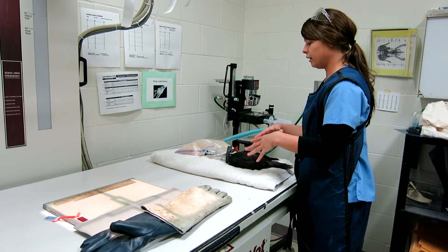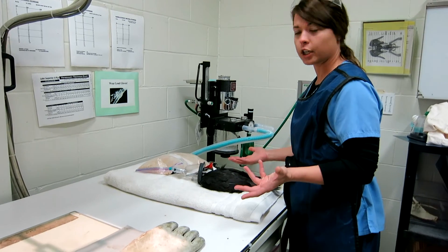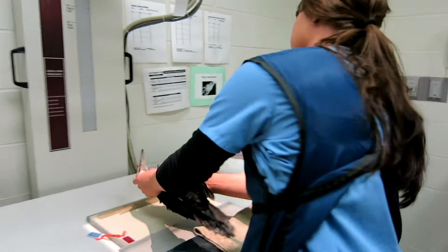Right now he is masked under isoflurane, so I can position him properly to take a picture. Once he's out, I can place him on the cassette.